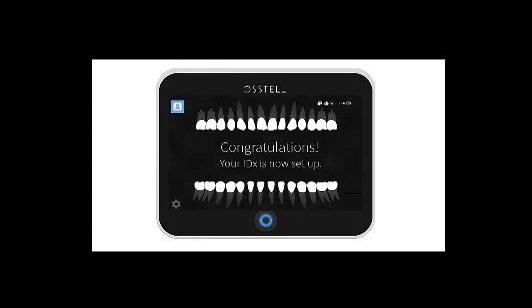Congratulations! Your Osstell IDx is now set up. Let's start measuring.